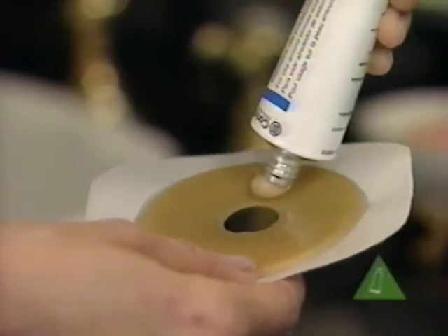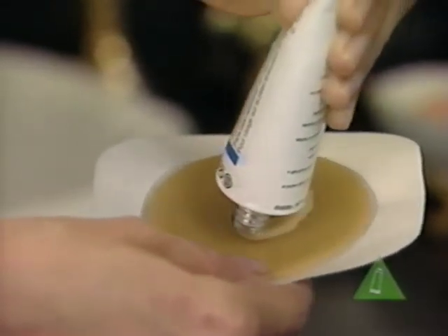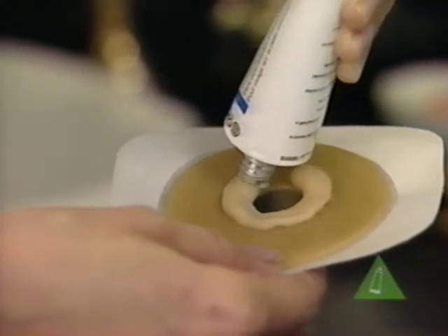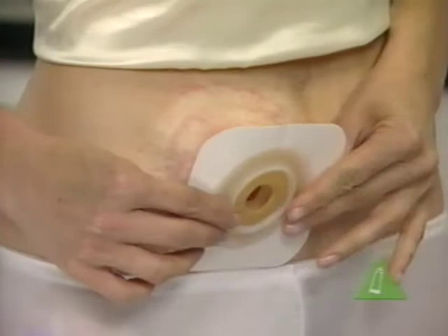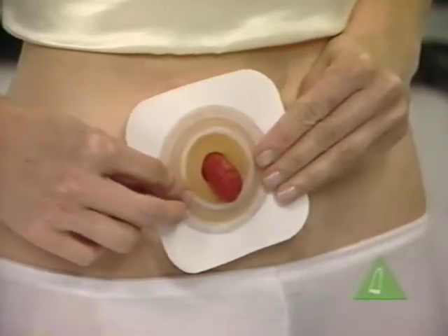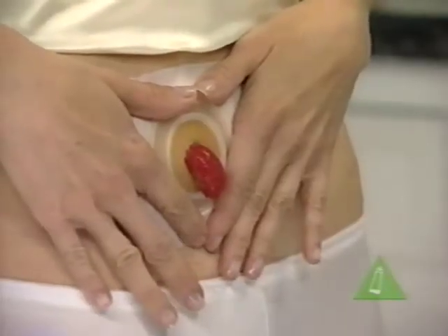Apply a thin ring of Stomahesive paste to the back of the wafer to fill the gaps between the wafer opening and the stoma. Allow the paste to set for 1 minute. Do not spread the paste. Gently press the wafer onto the skin closest to your stoma.